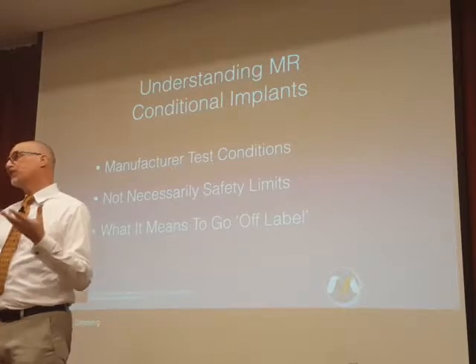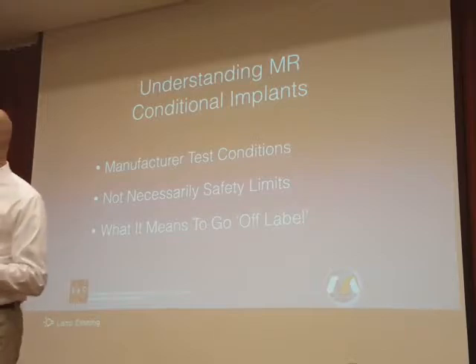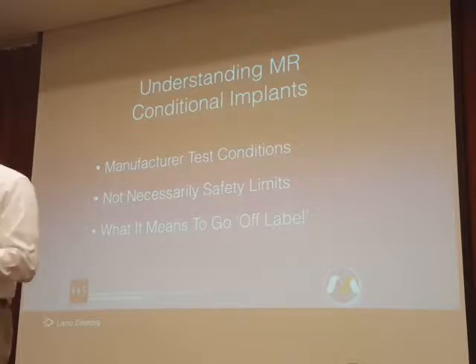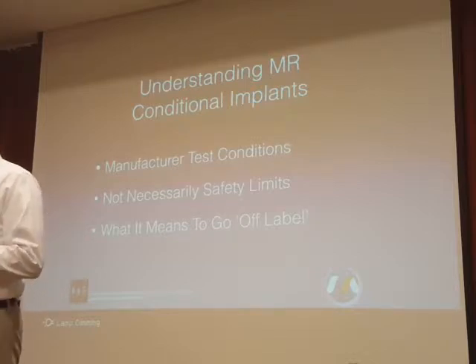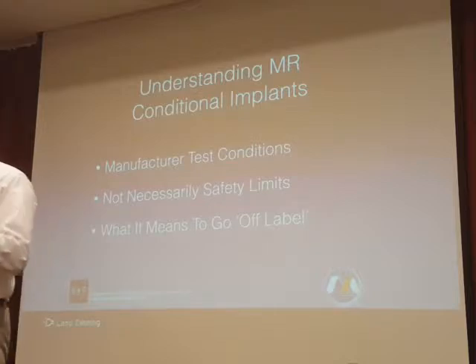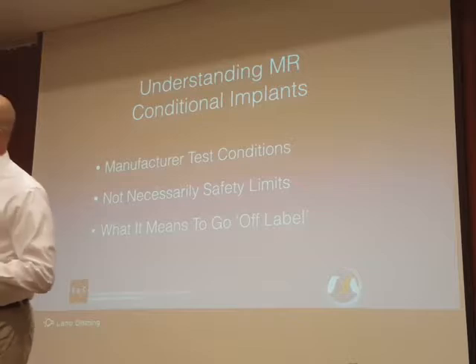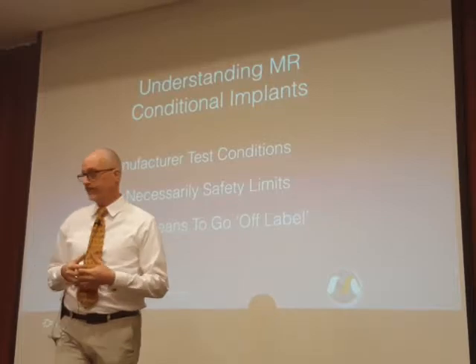Yeah. So patients with neurostimulators or pacemakers that require programming or changing of the active mode can be difficult logistically to try and get a vendor rep from Medtronic or whomever to come and bring the device that can interrogate the pacemaker or the neurostimulator, verify its condition in terms of its ability to go into an MRI safe mode, and then put it in that mode and then take it out again afterwards. And that becomes an important consideration for any of these programmable active implanted devices.